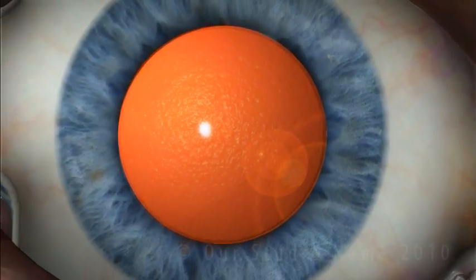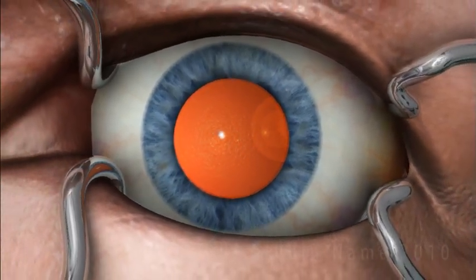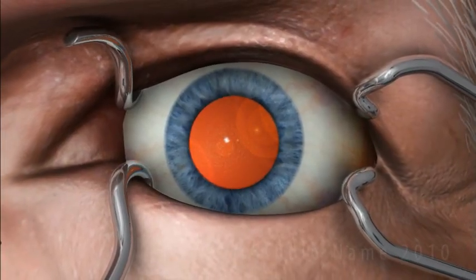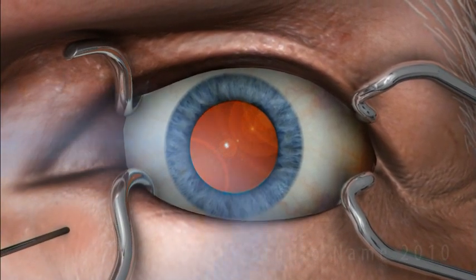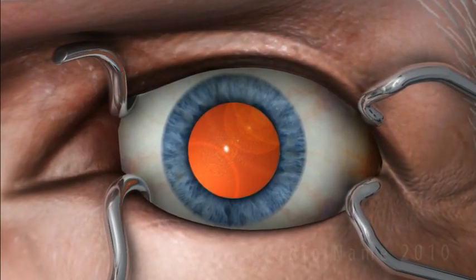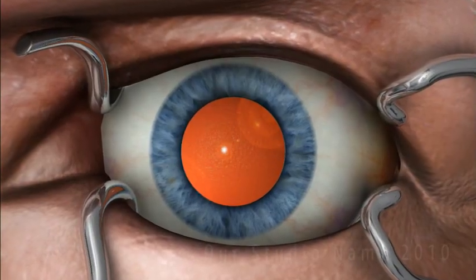To correct this, a doctor may recommend phacoemulsification cataract surgery. Before the procedure, the surgeon numbs the area with anesthesia. Pressure may also be applied to decrease the internal pressure within the eye, which will lower the chances of complications later in the surgery.